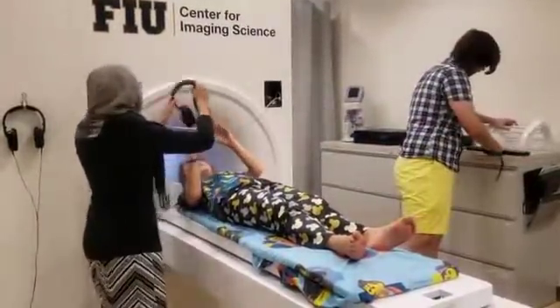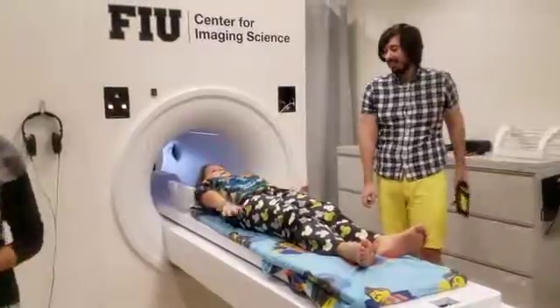Once you feel ready with the practice brain camera, we'll get you off the bed. Careful not to bump your head.